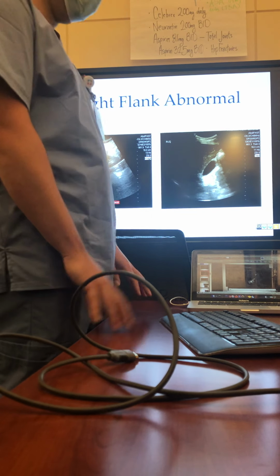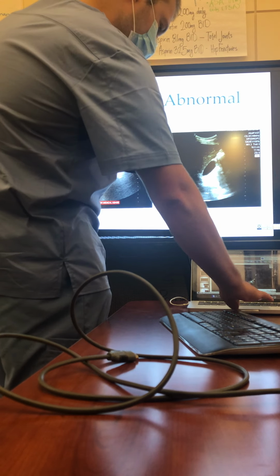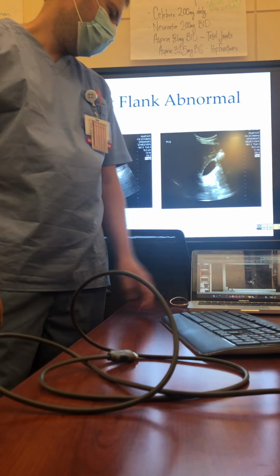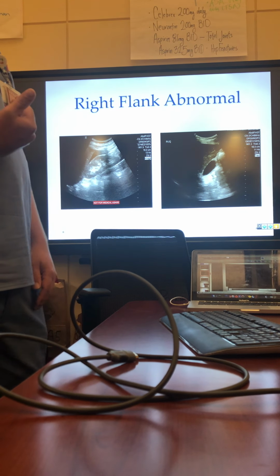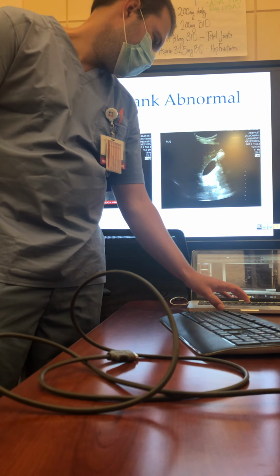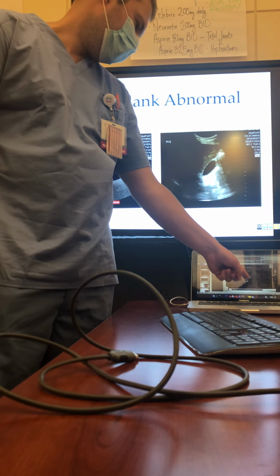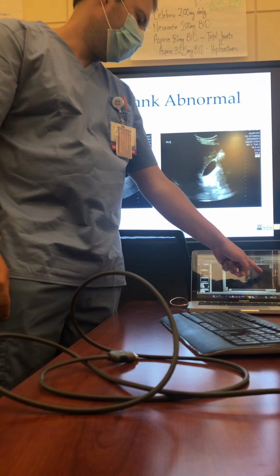You might call the gallbladder as positive, but it's important to scan through it because you'll see the difference when you scan through. You'll see that now there's fluid there. So that's actually Morrison's. Now that's the free fluid. The gallbladder's kind of underneath there. The gallbladder is actually anterior, but kind of down when he's moving the probe. Yes, exactly. See it coming right there. That's the gallbladder. But there's free fluid here, there's free fluid up there.